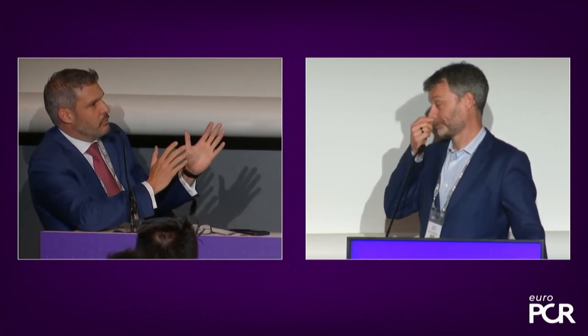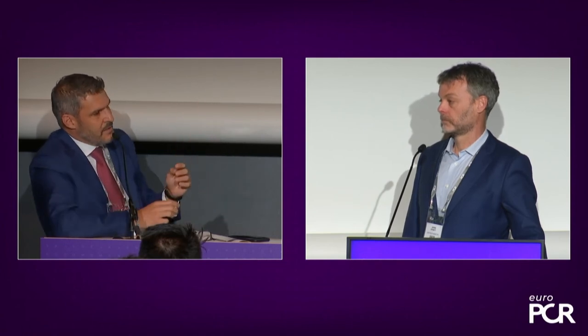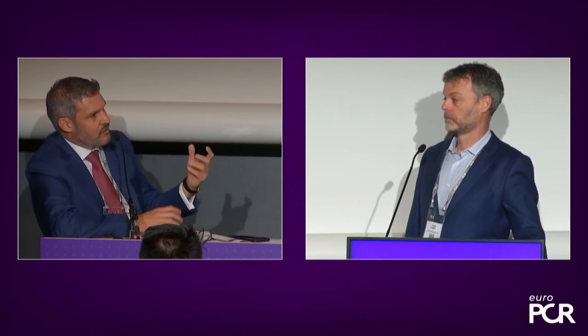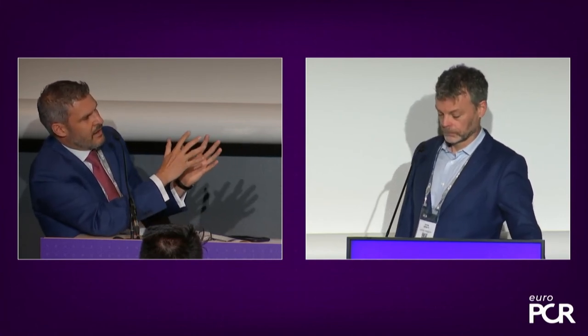Okay, I have another question for you, James, because you mentioned intravascular lithotripsy. Sometimes IVL could be useful in some complex reverse CART in which you are not able to create any connection by ballooning with a standard balloon because the calcium between the two wires represents a barrier. So my question is, can lithotripsy work just if the antegrade wire is intraplaque to create some connection, or even if your antegrade wire is extraplaque?